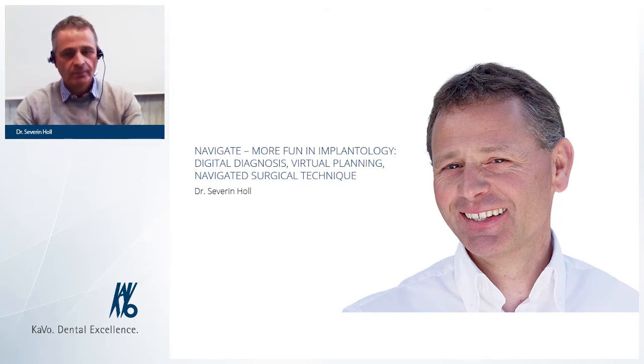The lecture of Dr. Severin Holl contains numerous videos that impressively document patient cases and all steps from the implant planning to the final restoration. The main topics are the digital workflow, the basics of 3D X-ray devices, virtual planning and prosthetic implementation, and the indication spectrum of digital implantology.